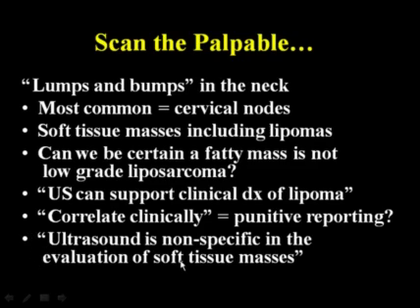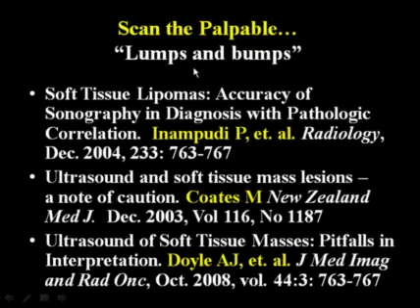Usually what I will say is ultrasound is non-specific in the evaluation of soft tissue masses, and sometimes if I'm looking at a lipoma, I'll say cannot distinguish lipoma from a low-grade liposarcoma. Here are some of the articles in the literature which I have found. Notice some of the titles: ultrasound and soft tissue mass lesions, a note of caution; ultrasound of soft tissue masses, pitfalls in interpretation. So there's not a lot of compelling literature about our ability to diagnose these soft tissue lesions.